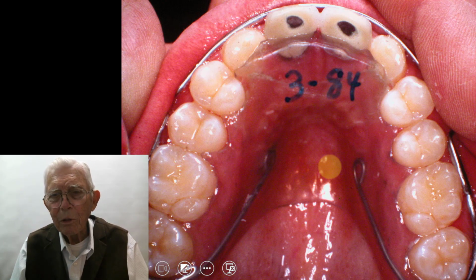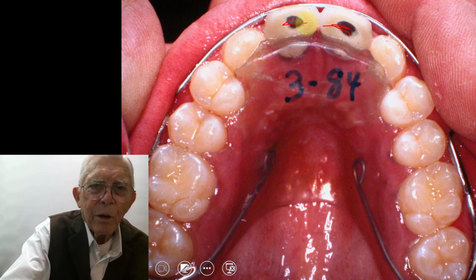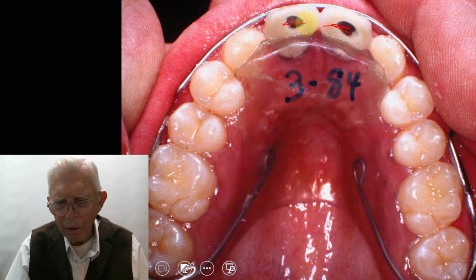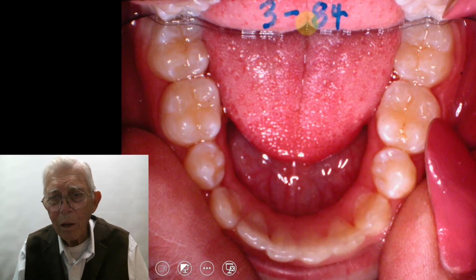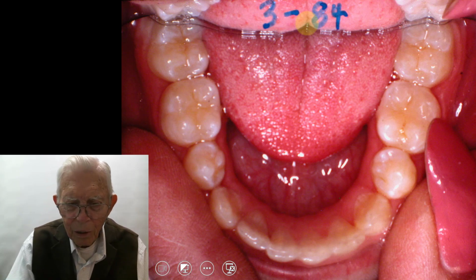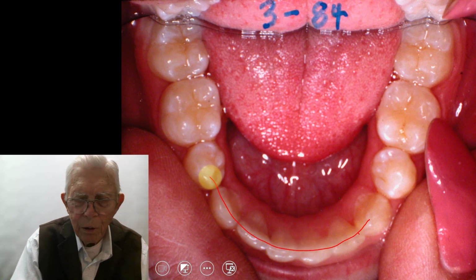Now his centrals, they put crowns in there, but they wore through the crown right there. And you can see the core that they have. They may have made a gold core on it to put over this, but it's worn down through that at this point. Now, here I don't see any wisdom teeth in the mouth, and that one I don't see either. But the lower anterior teeth, this is 84, are lined up real good right in here.